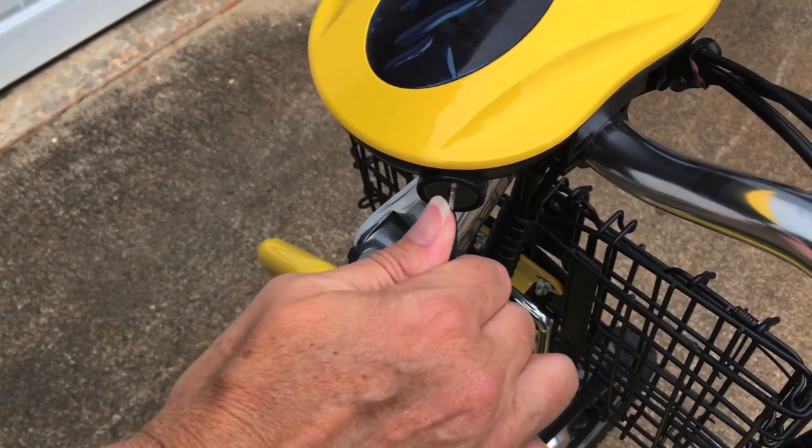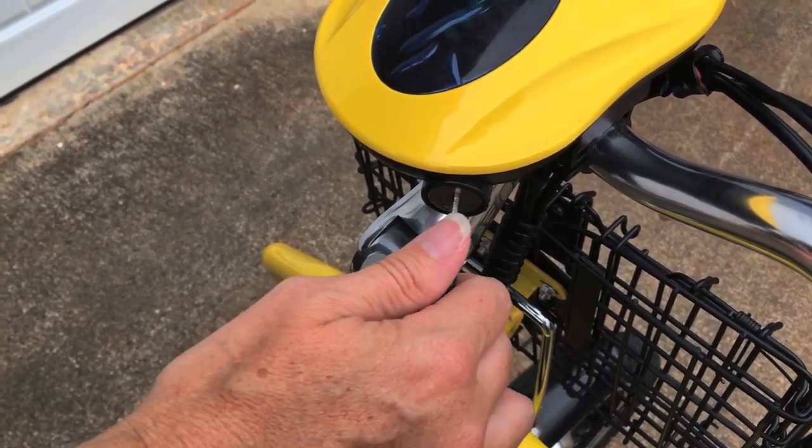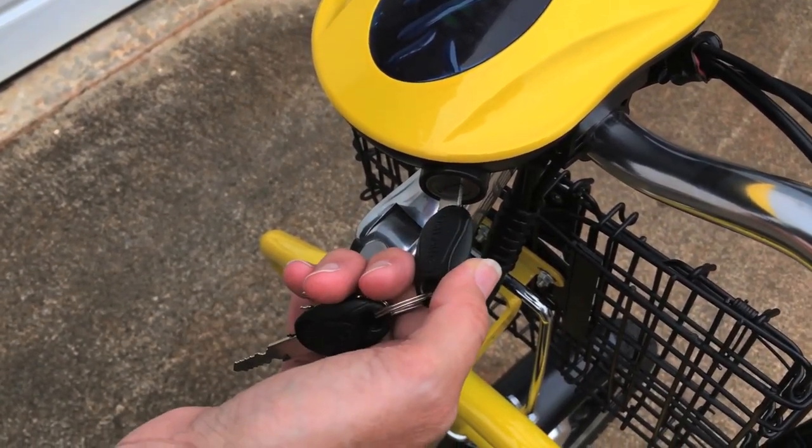This is how you turn on your Tricaroo. One click turns on the Tricaroo, two clicks will turn on your front headlight.